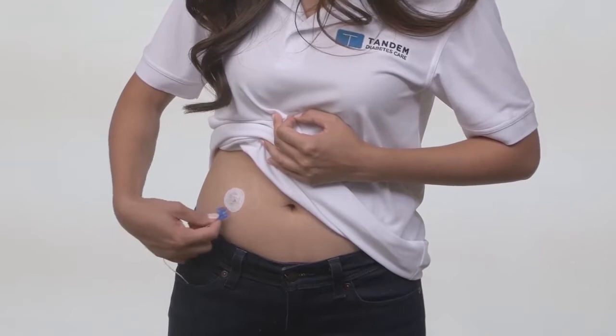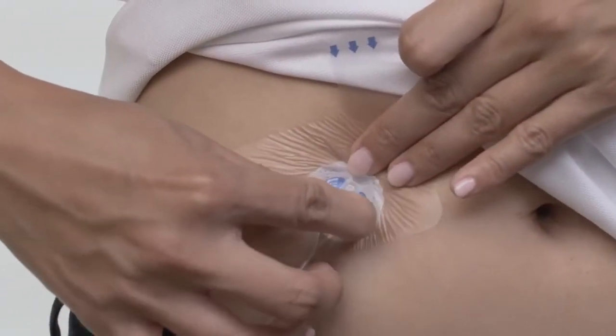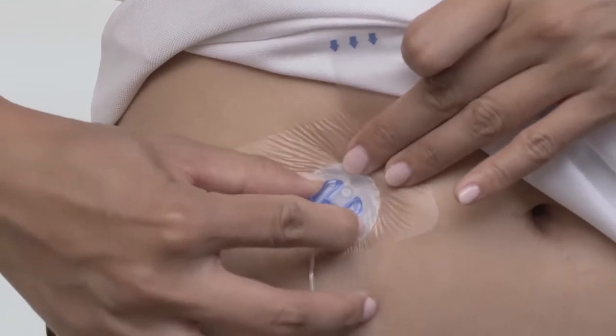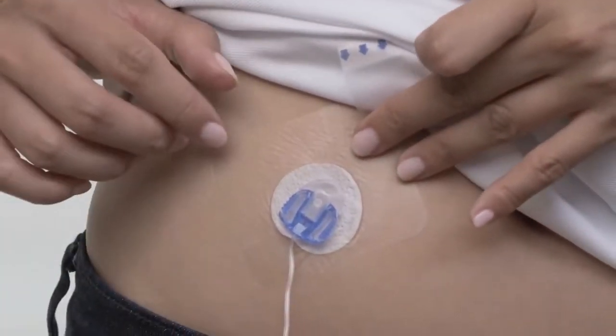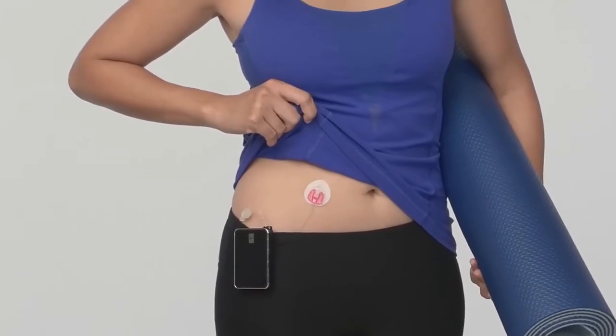You may find that sometimes you have trouble keeping the infusion set stuck to you. This can happen for a variety of reasons. The type of set you use, the kinds of activities you do, and even your own unique skin chemistry can all affect how well a set stays attached.